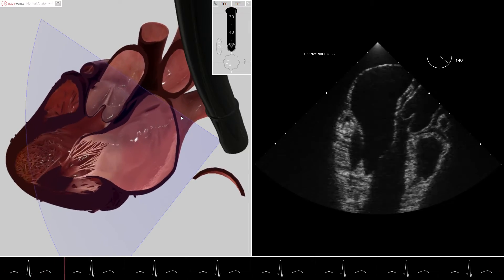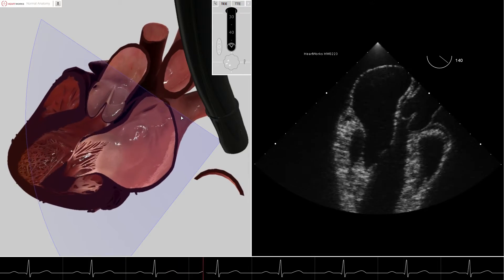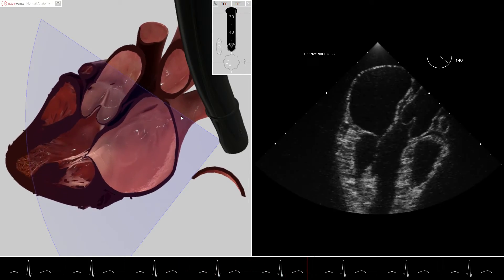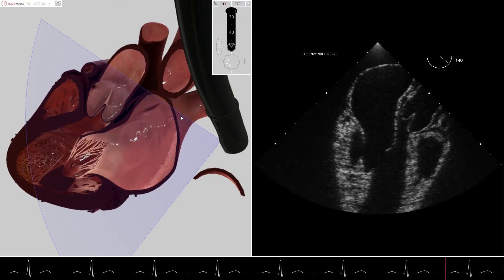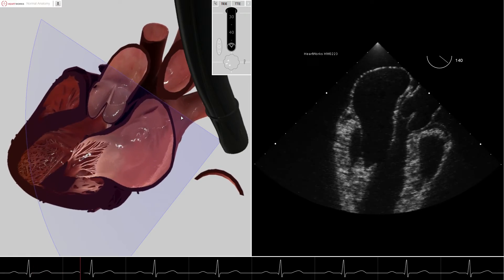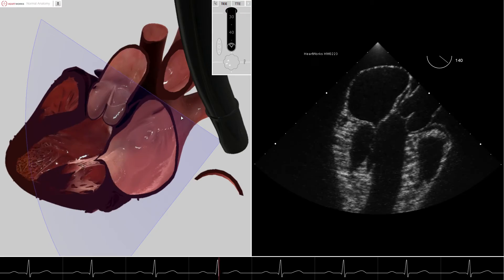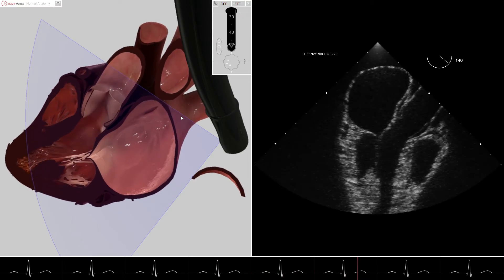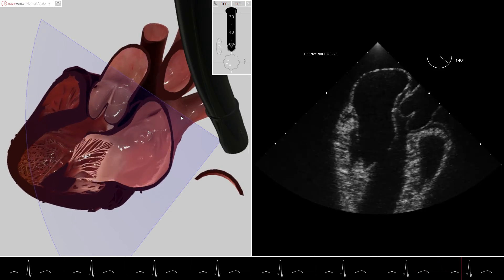It can be seen that understanding mitral valve TEE anatomy is based on an understanding of the orientation of the omniplane in the mid-esophageal 4-chamber view, mid-esophageal mitral commissural view, mid-esophageal 2-chamber view, and mid-esophageal long axis view, in addition to understanding the representation of the cut plane by the 2D ultrasound image.